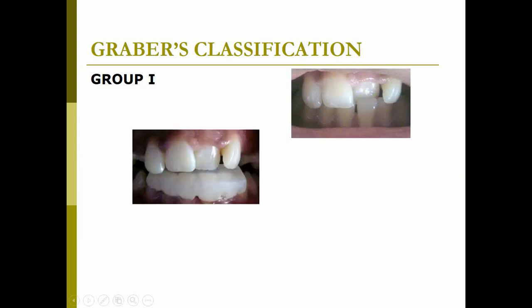So to correct it, I give a lower inclined plane. This can be categorized as a type of myofunctional appliance. That means this group 1 is an appliance which is acting directly on the tooth, and it is actually not going to grow your bones, but yes, it has saved your maxilla. So it is going to redirect your maxillary growth indirectly.